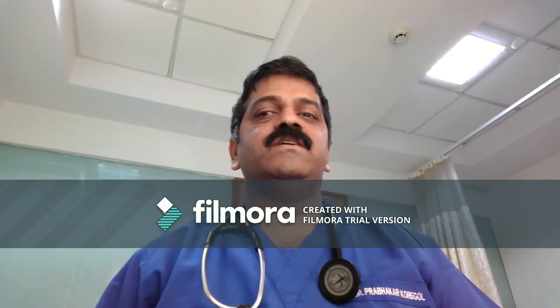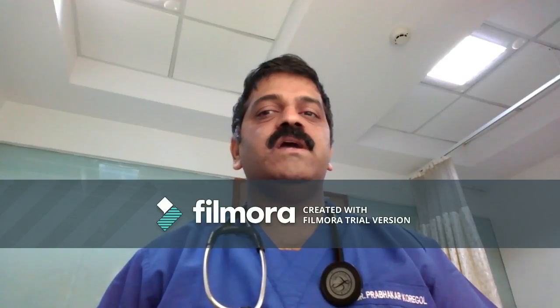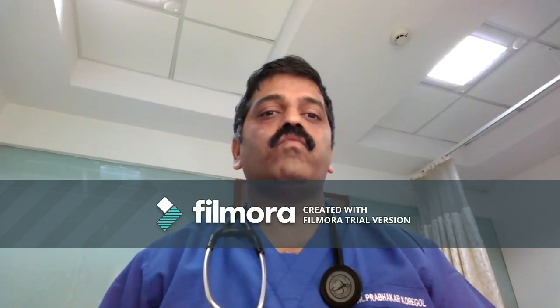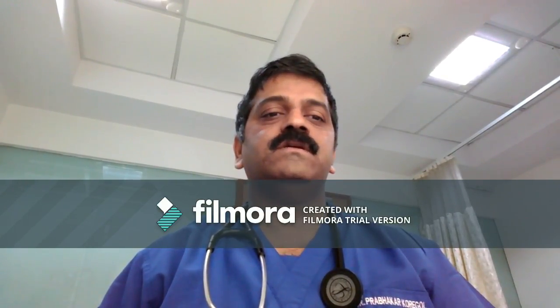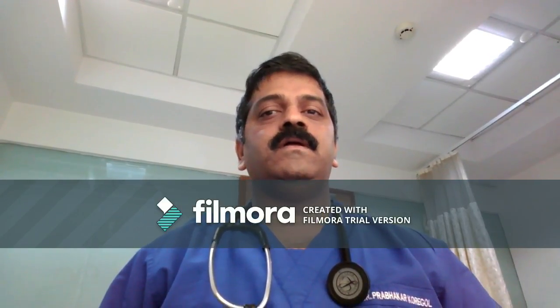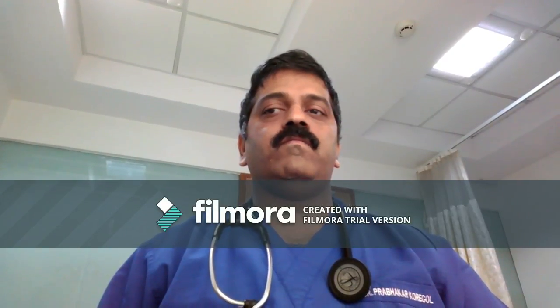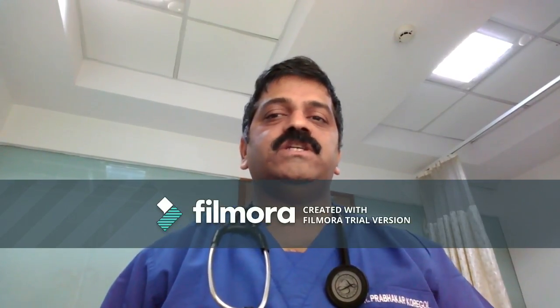Today we'll talk about the ECG in acute ischemia and acute myocardial infarction. ECG plays a very significant role in the management of acute ischemia.